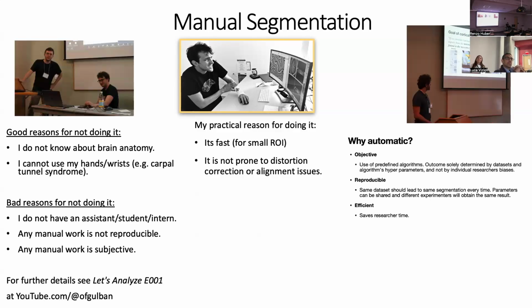There is a debate going on on whether it's okay to do manual segmentations, or if it's maybe even unscientific to do layer-dependent segmentations, or if it's the most efficient approach. That highly depends on the application. Do you need whole brain?